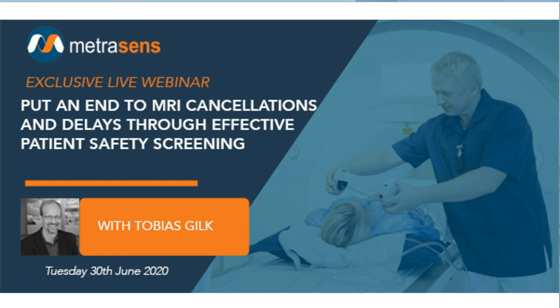You get somebody who is 5 foot tall, or a pediatric patient, and all of a sudden I become a lot less confident in that answer, because now we're moving that retained pacer lead closer and closer to both maximum time varying gradient amplitudes and to the RF transmit volume. So each of these things in a structured risk assessment should be weighted as a part of the overall answer. I hope that helps.